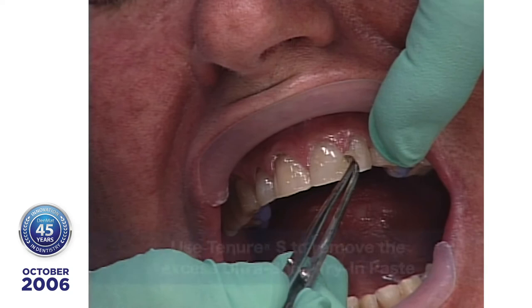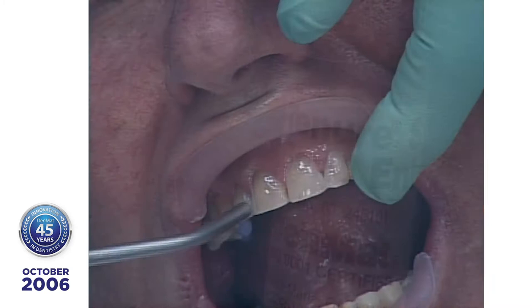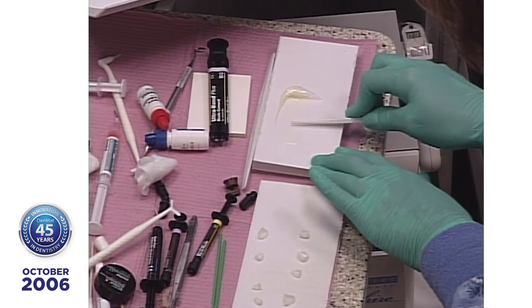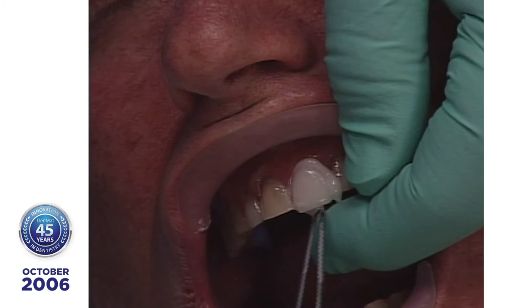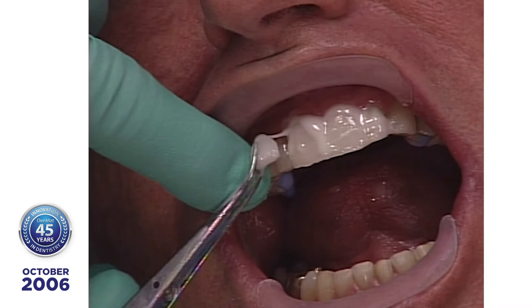And what I'm doing right now is removing the try-in paste. I'm removing it with a material called Tenure S, and that's a bond enhancer. And I'm going to put this all over the surface areas that I've treated with Tenure AB. And that's important because once you have done surface preparation, a race begins between resin and contamination. Whatever gets there first wins. Lisa's using Tenure S to remove the try-in paste from the inside of the Lumineer. And you never want to put the Tenure S on before you put the try-in paste on because it's going to set it. So it's a backup for you.